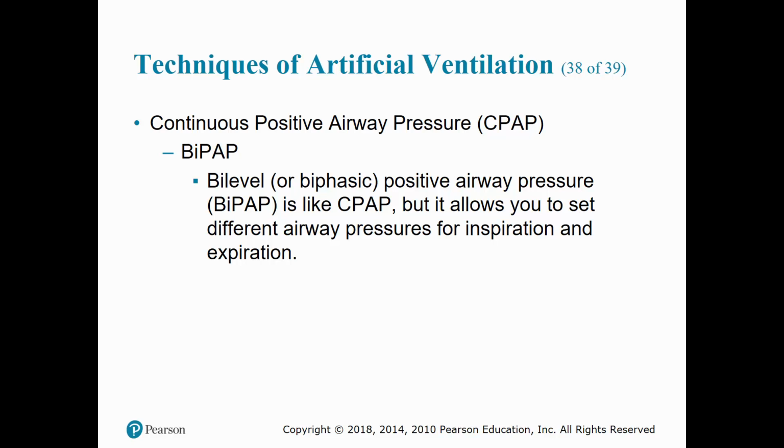BiPAP, or bilevel positive airway pressure, is like CPAP. With BiPAP, one level of pressure is delivered when the patient inhales, also known as inspiratory positive airway pressure, and one level of pressure is delivered when a patient exhales, known as expiratory positive airway pressure.